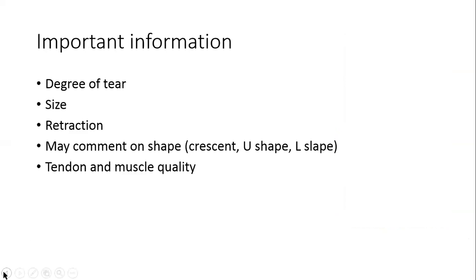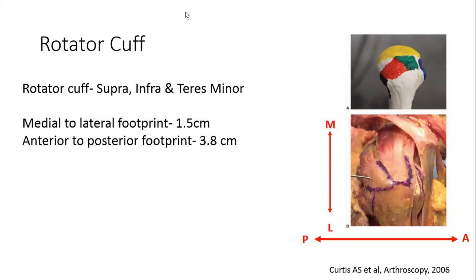Any questions so far on the footprint or the attachment of supra, infra, and teres minor? Maybe some case that you recently scanned, any recent patient where you had some trouble, and maybe it's ringing a bell? No. All right, so I'll move on to the next one.